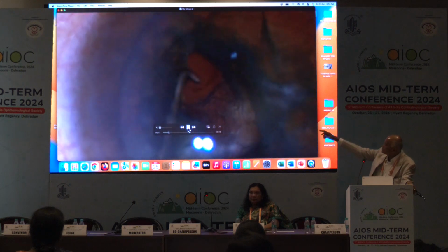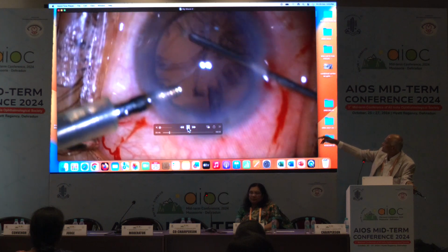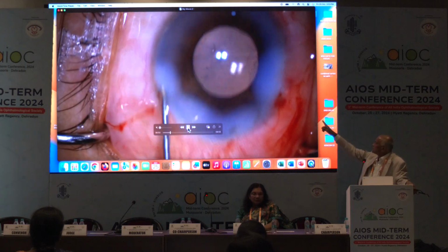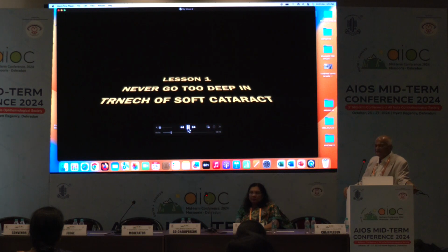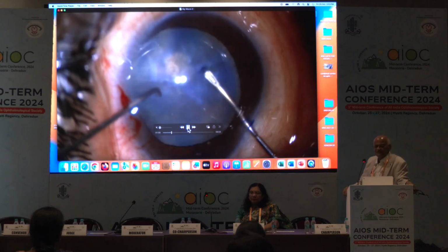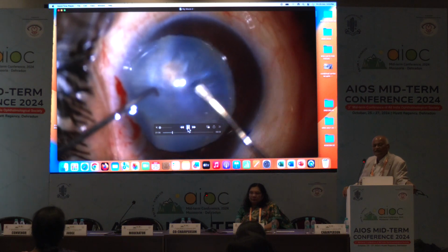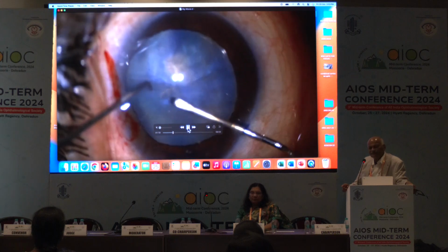So I was, see now what I have done. See here. So where it is, near the iris. Can you see this? Now what I am doing is, I am doing the vitrectomy. So always remember, when you come to know that you have done the vitrectomy, after that you can put this, now see here, it's a fibrous lens. See, I am doing the rhexis, and what is happening? Nucleus is moving. Why? Capsule is thicker, fibrous capsule.